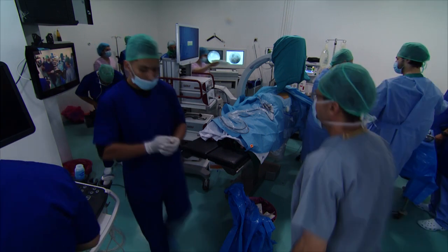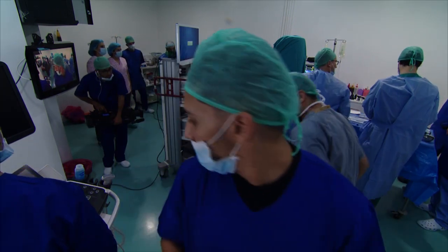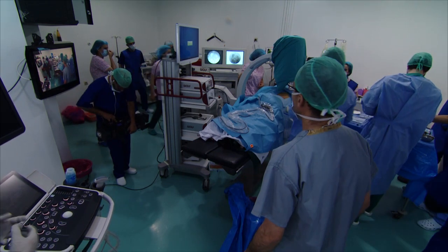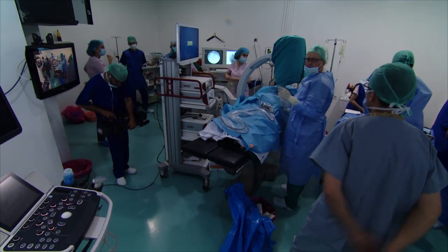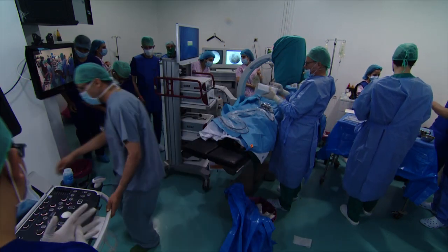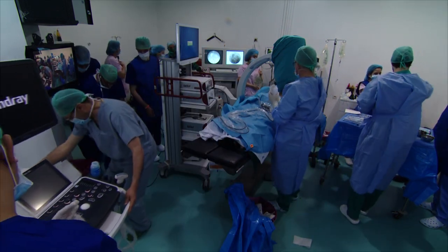This is for the camera, but you can. Camera is ready. Ultrasound. Yeah, you can use it for ultrasound. This is the guiding system. You can fix the ultrasound on the probe. This is the tube.